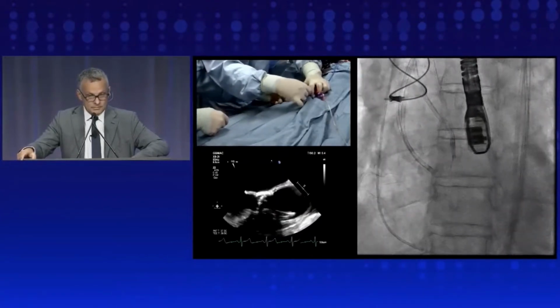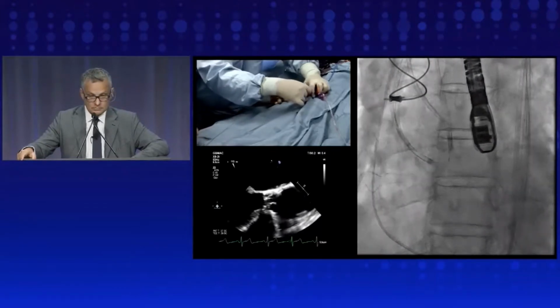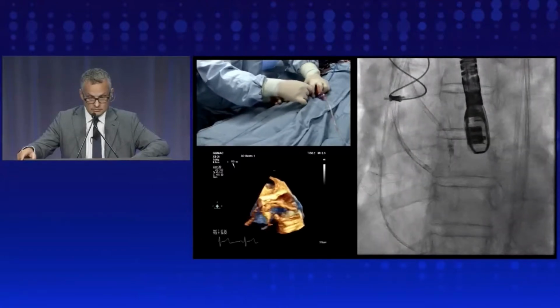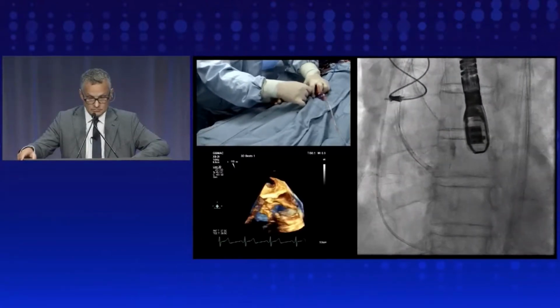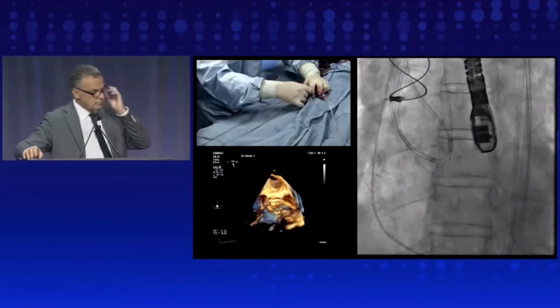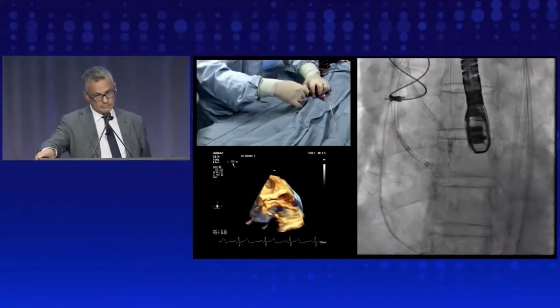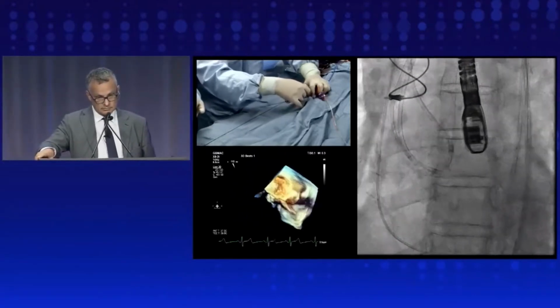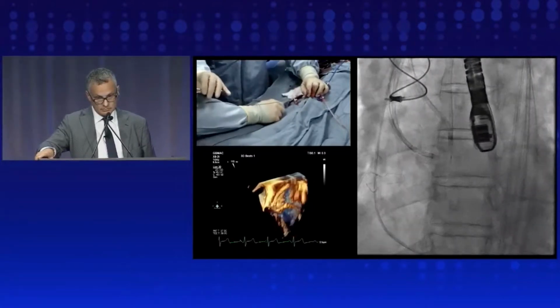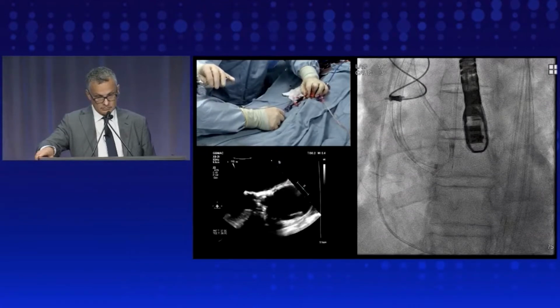So right now he's driving up as Jamie is pulling, and the idea right now is to get that kink to be right at the base of that cusp. And you'll see it come in, it almost snaps into place. You can see a dot there. The dot on the wire is related to the left cusp. Maybe I'll move to a slightly different projection that you'll appreciate.